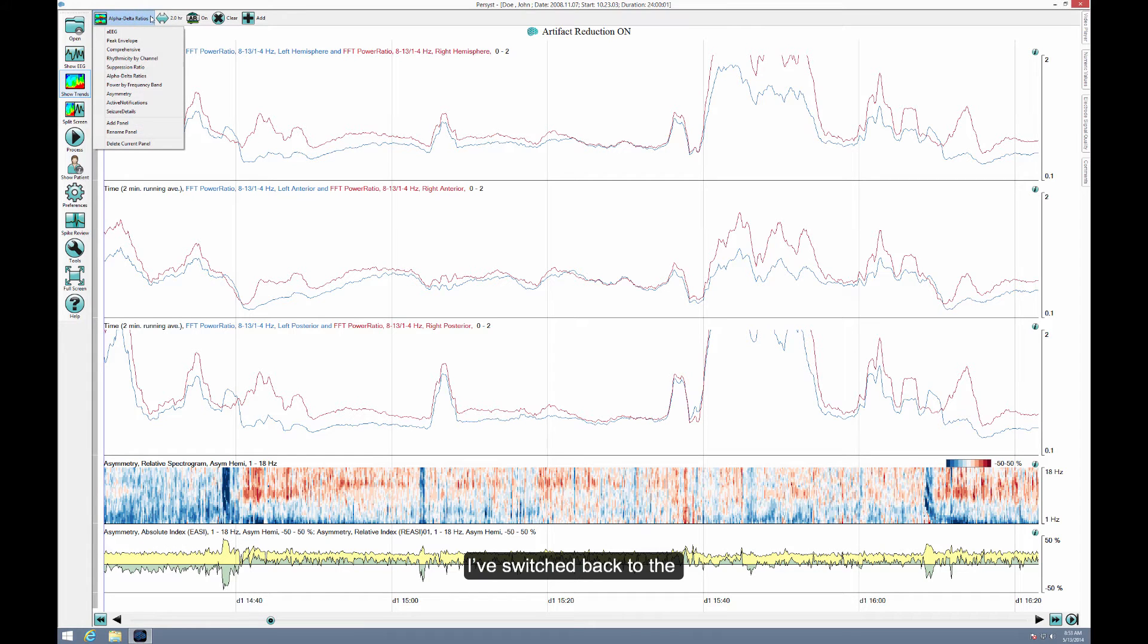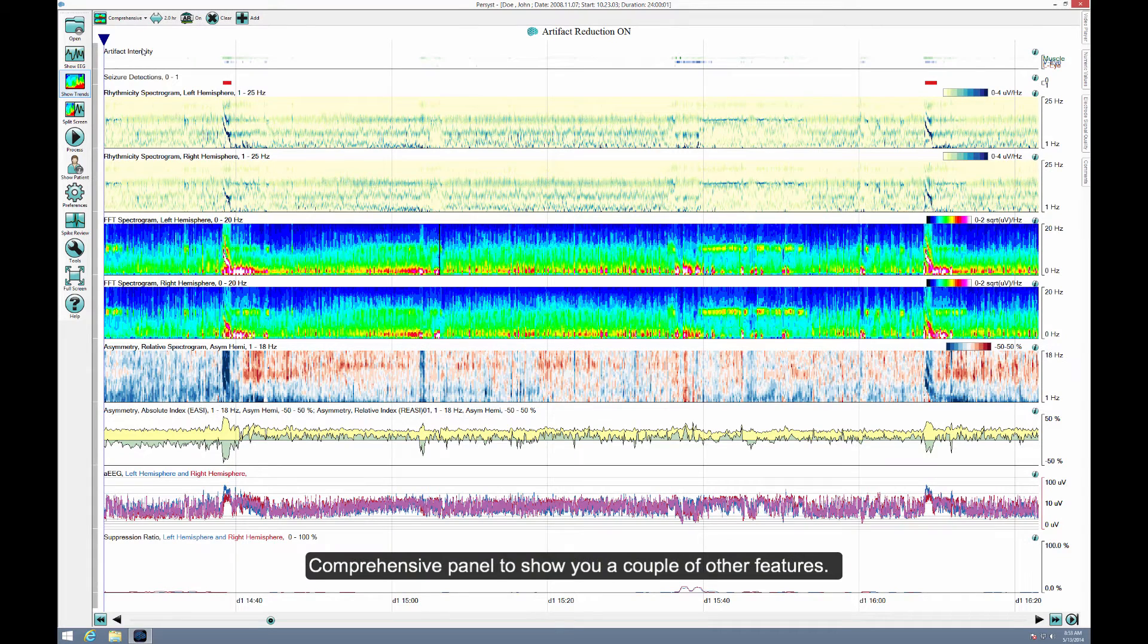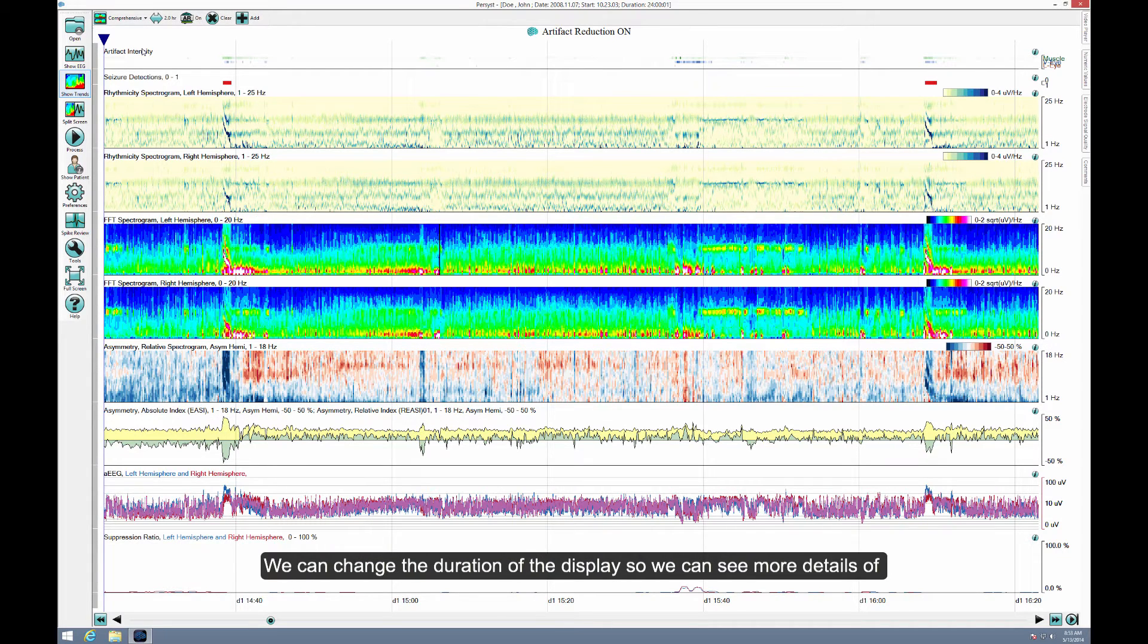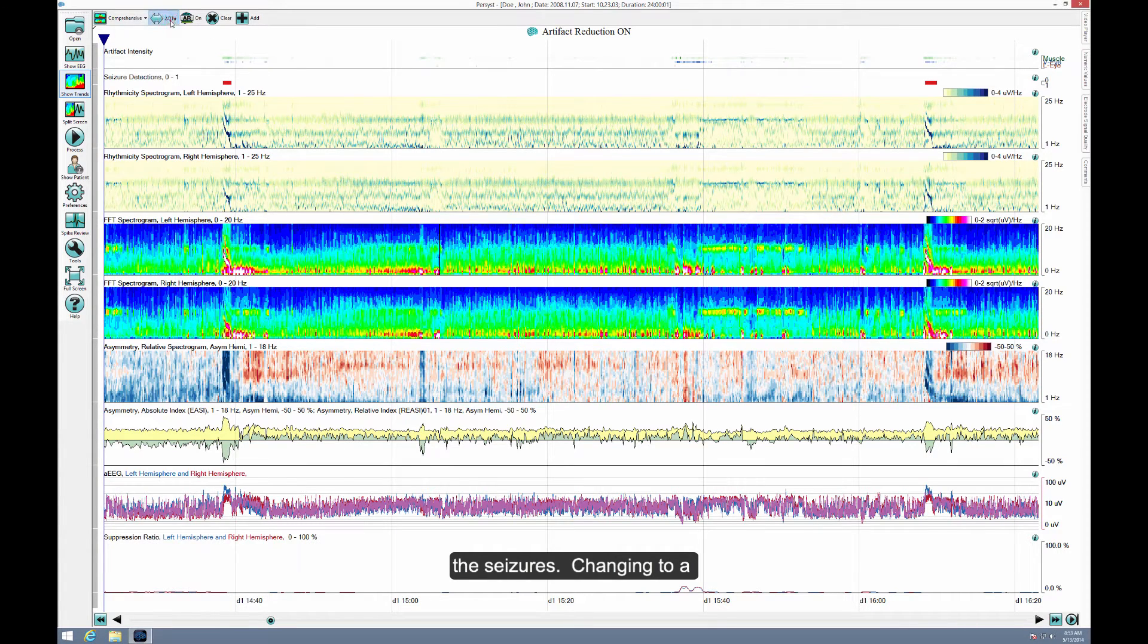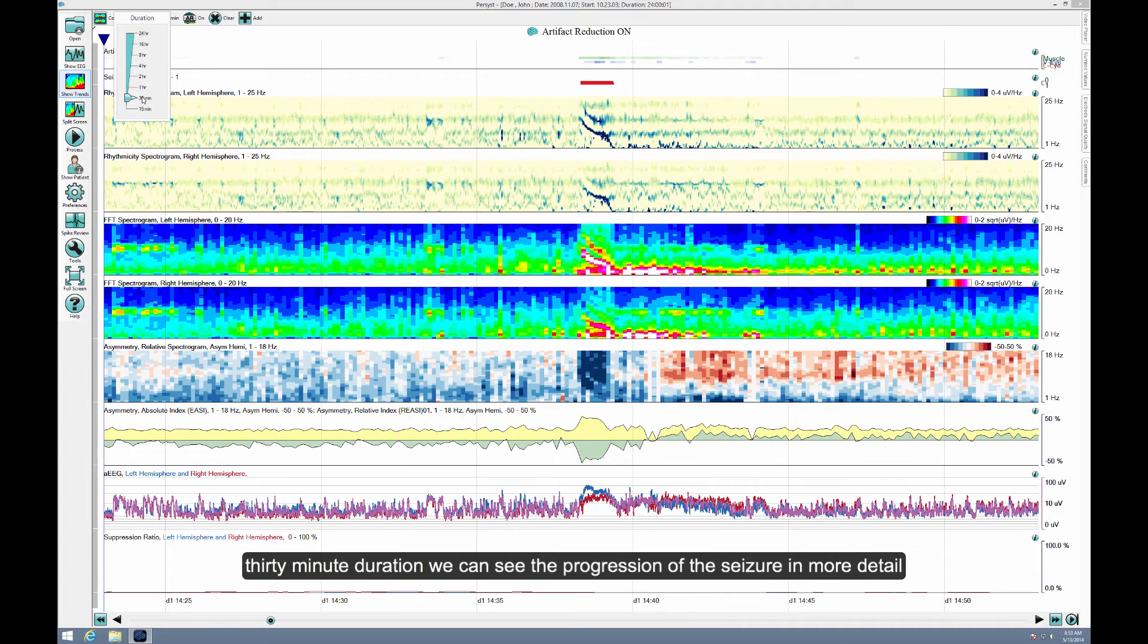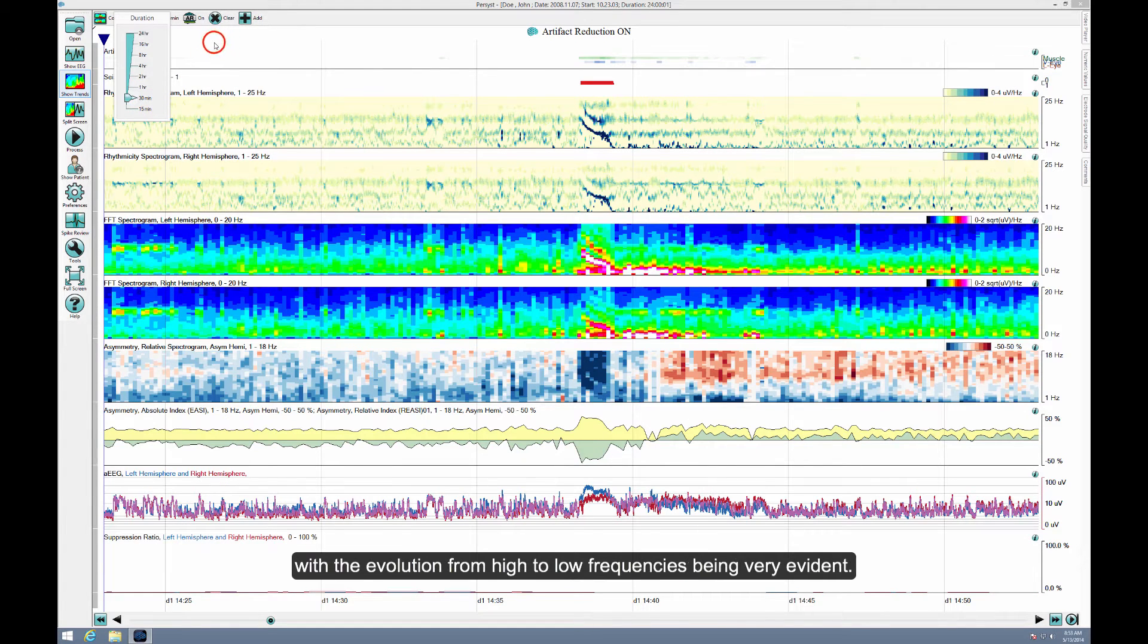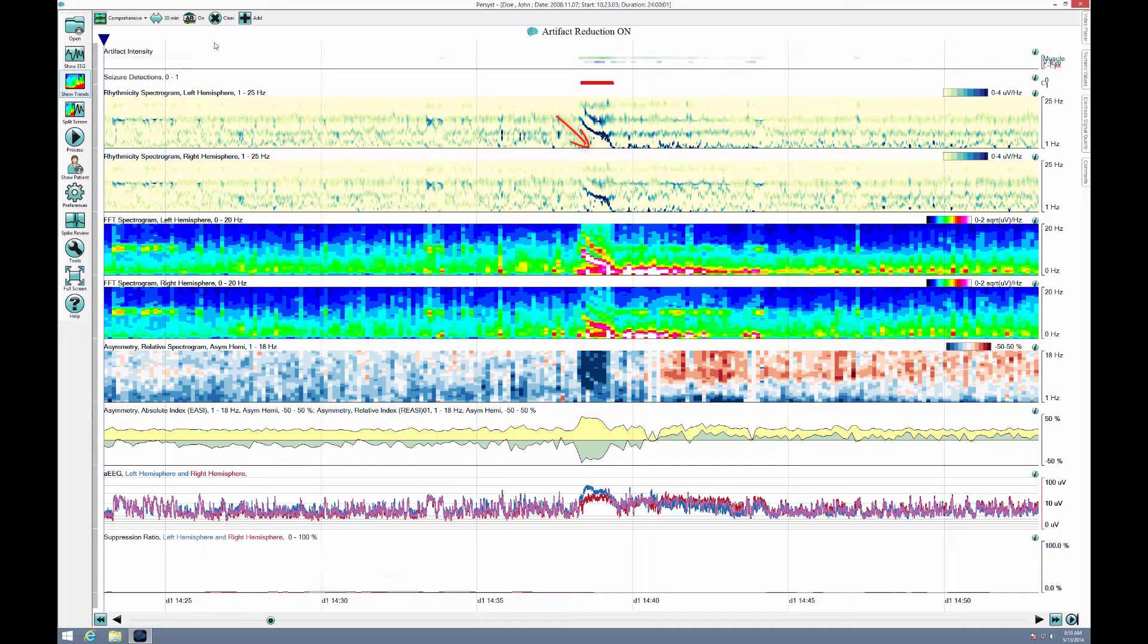I've switched back to the Comprehensive panel to show you a couple of other features. We can change the duration of the display so we can see more details of the seizures. Changing to a 30-minute duration, we can see the progression of the seizure in more detail, with the evolution from high to low frequencies being very evident.